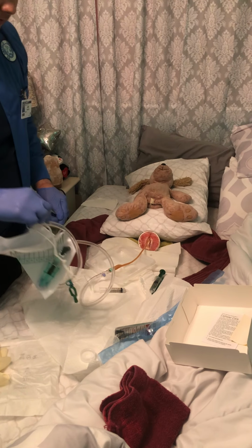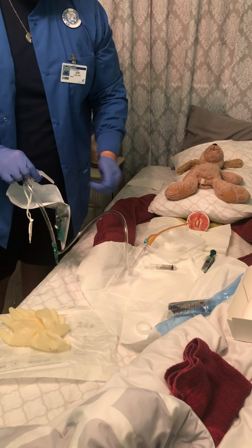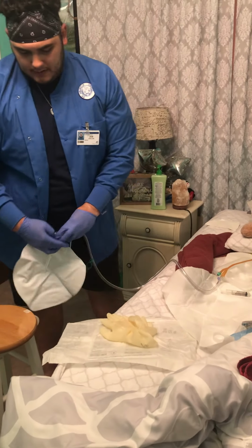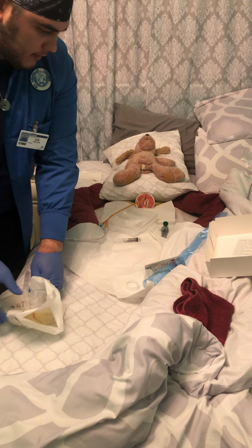So you want to place the Foley bag, obviously below the bladder, and you never want to place it on the bed rails, so you always want to just hang it on the frame of the bed, as so. I'm going to go ahead and clean up.